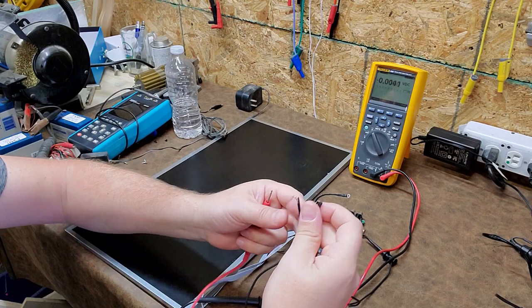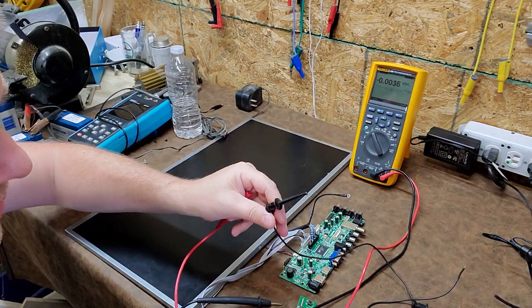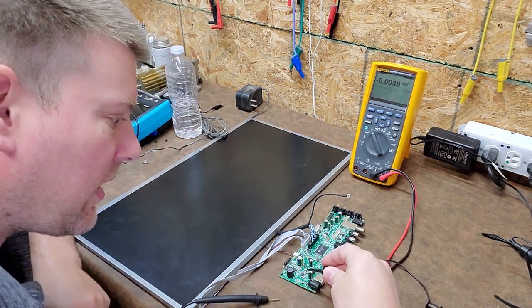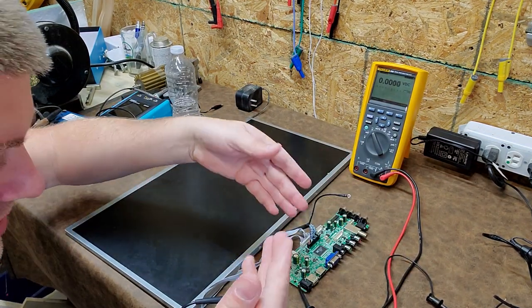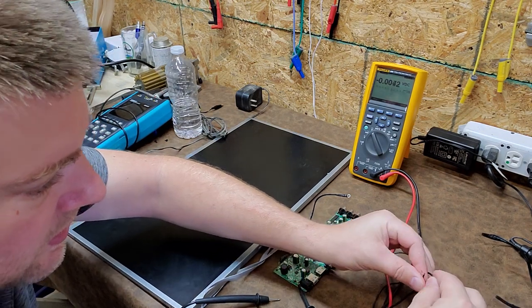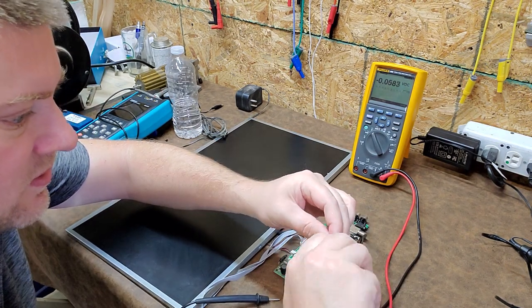Okay, so this one right here is positive. So for the positive, the first thing I'm going to do is clip it straight onto the fuse, on one side of the fuse. So in case it does pop, it's going to pop that fuse, so we're safe. All right, and I'm going to connect the negative side right here. I'm going to twist these two together.